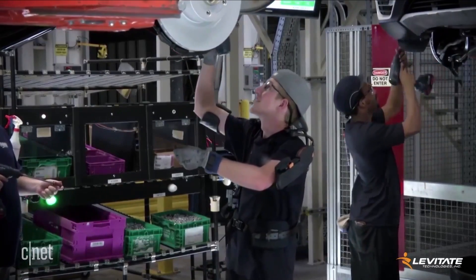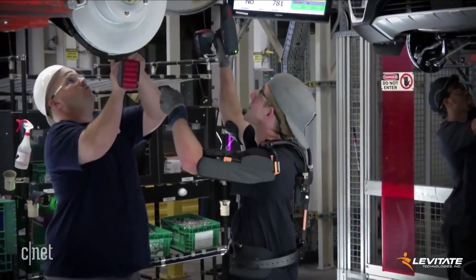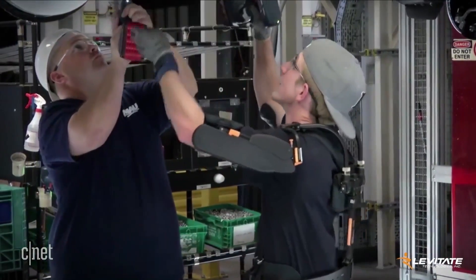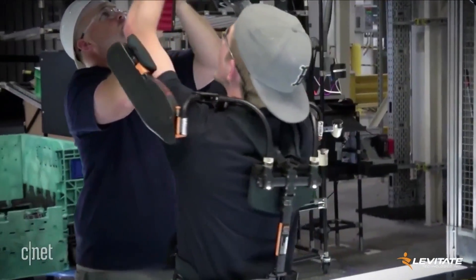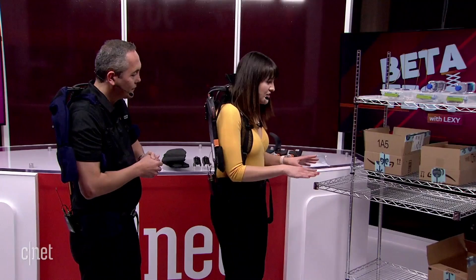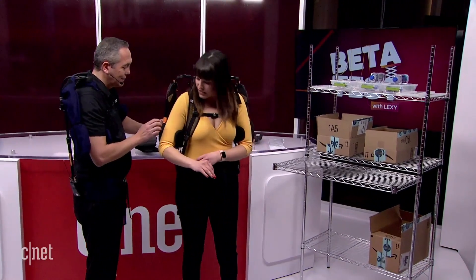We're looking at footage of the Airframe being used in current factory settings. There's a lot of overhead work — drilling and things like that — and this supports the arms to make that easier. Obviously, that's a factory-specific situation, but we've simulated something factory-like here with some shelves, and I think you're going to put me to work.